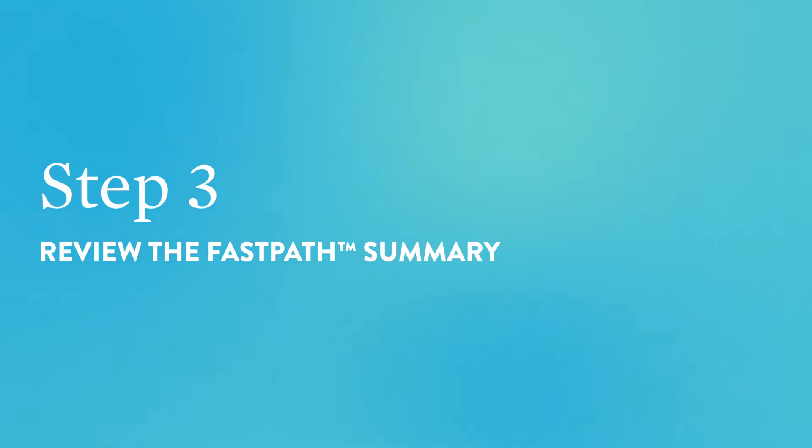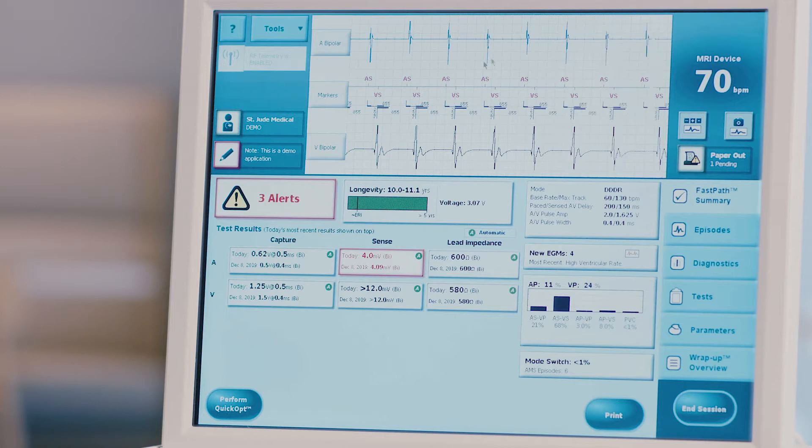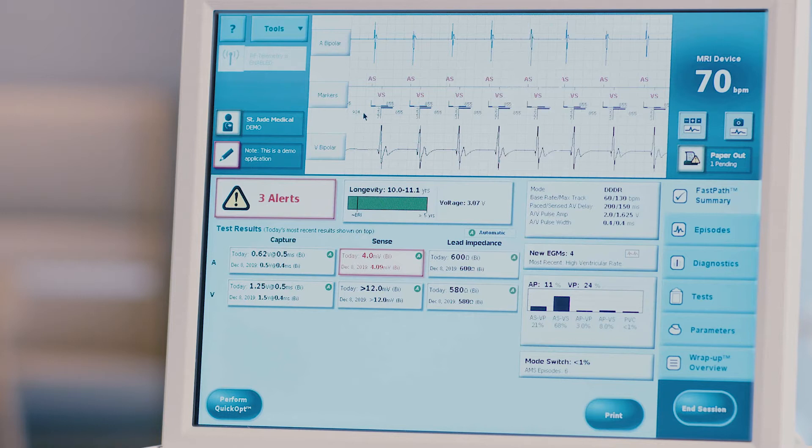Step 3: Review the fast path summary. This home screen will provide an overview of diagnostic information. Assess the patient's rhythm at the top of the screen in the live EGM display. Make note of the signals and markers present. Assess the battery voltage and longevity estimate.